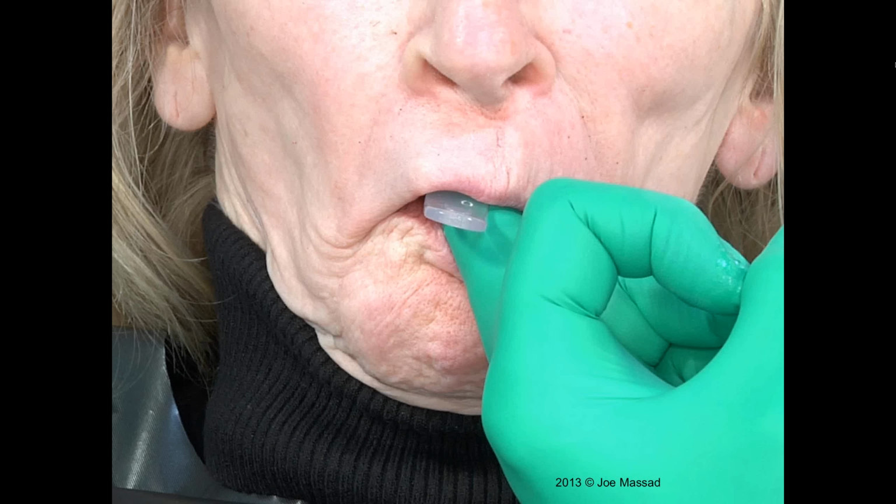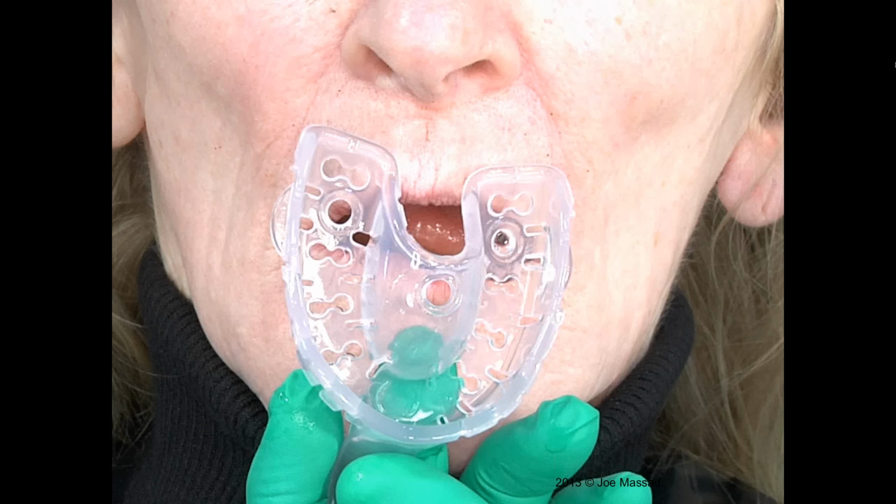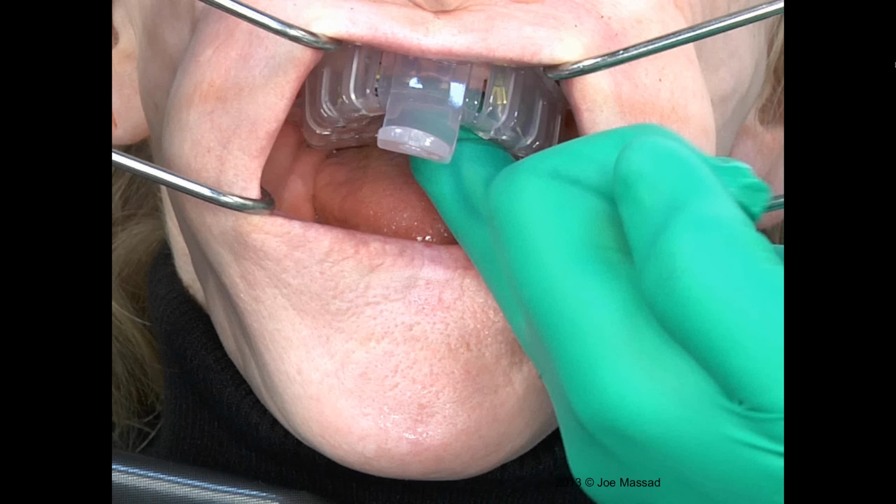You can see on one side how the tray just warped in, and I can see each of the implant impression copings. In fact, I know where each of the screw heads are. So it's going to be now much easier for me to negotiate and open up the tray, where I'll be able to retrieve the open tray impression copings when I finish the impression.